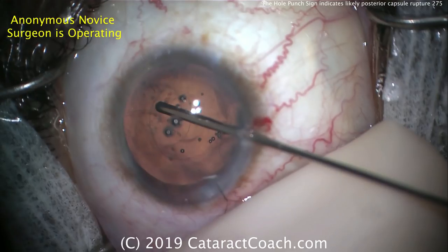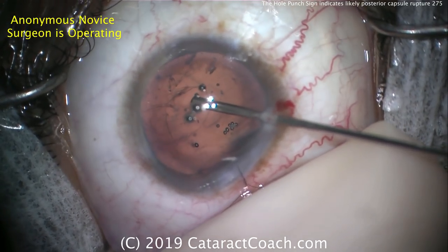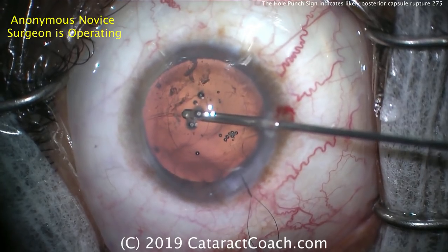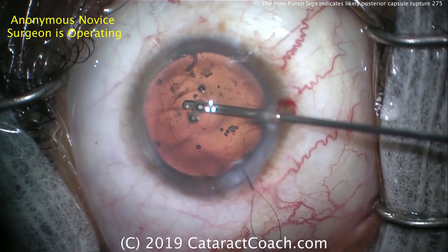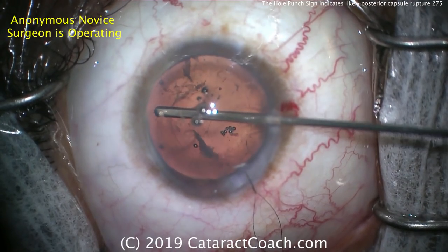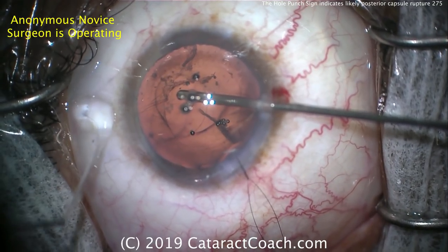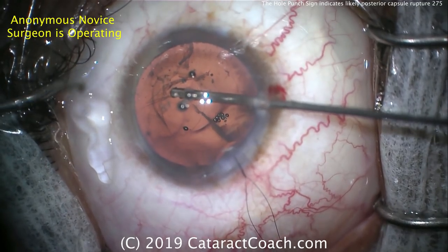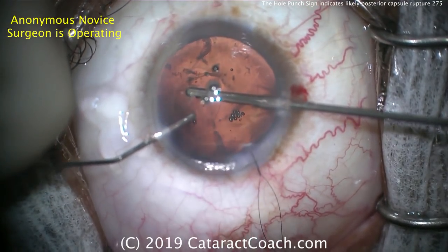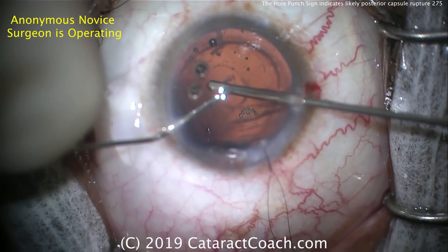Removing the lens material here — all the nuclear pieces were removed and the vast majority of lens cortex fragments are also being removed. Keep in mind this patient still may have a small bit of lens material retained in the vitreous cavity, so watch the patient very carefully in the post-op period. Dilate the patient, look at the retinal periphery. This patient is at high risk for retinal break as well as endophthalmitis — we can have a higher rate of endophthalmitis, macular edema, and retinal complications like break or detachment in an eye with a ruptured posterior capsule.